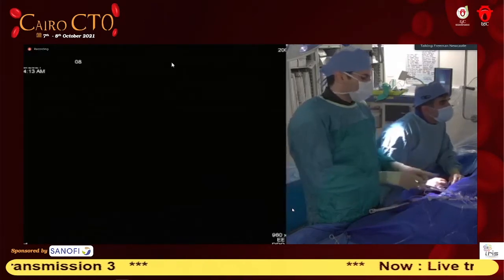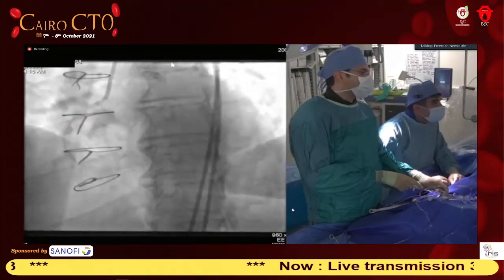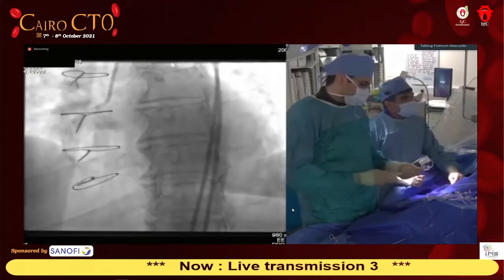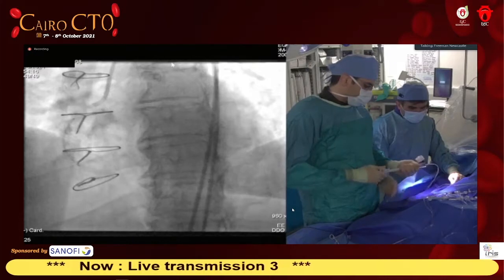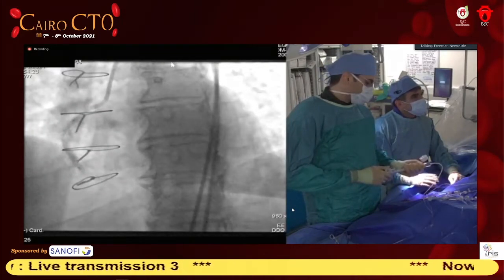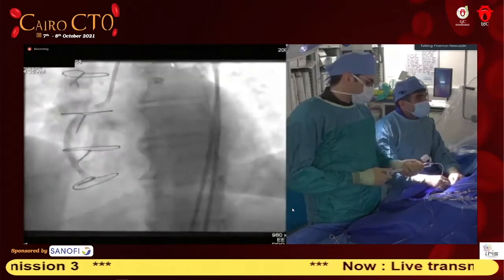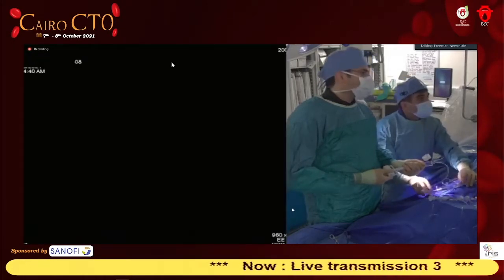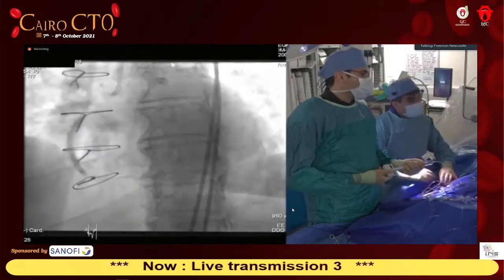Yes, overlapped. No, just a little bit further. Okay, go up there. This is 3.0 by 8? This is 4.0 by 8. 4.0, okay. Yeah, we'll just deploy it slowly and at lower pressure. We could always go higher pressure if we need to, which we will, I suppose, in a minute. Okay. Store that for me. And down.